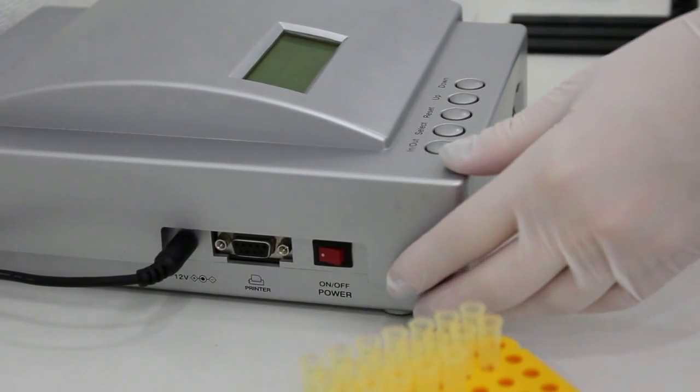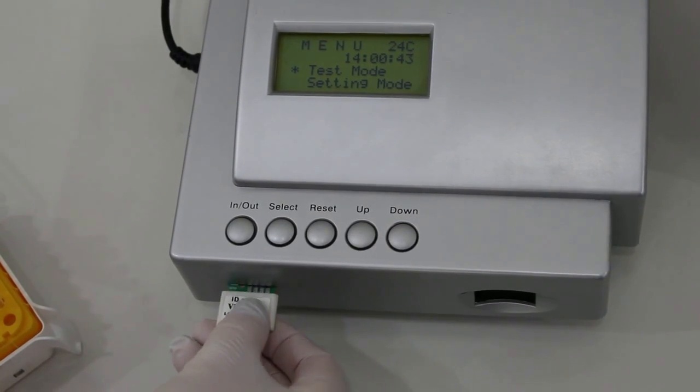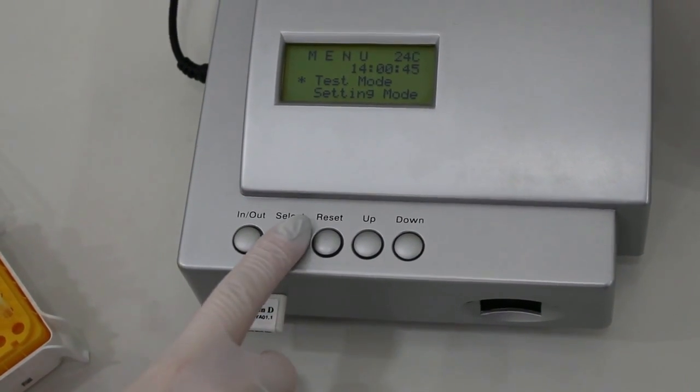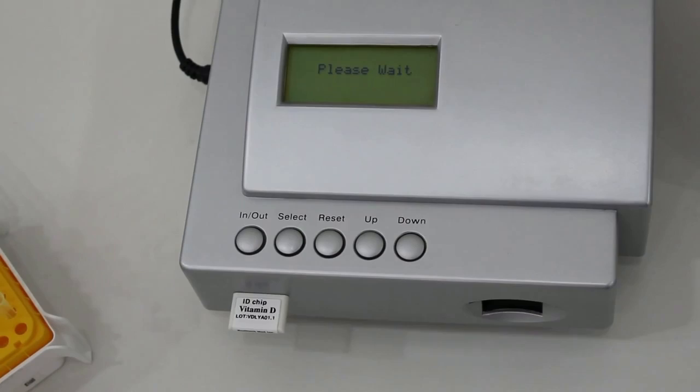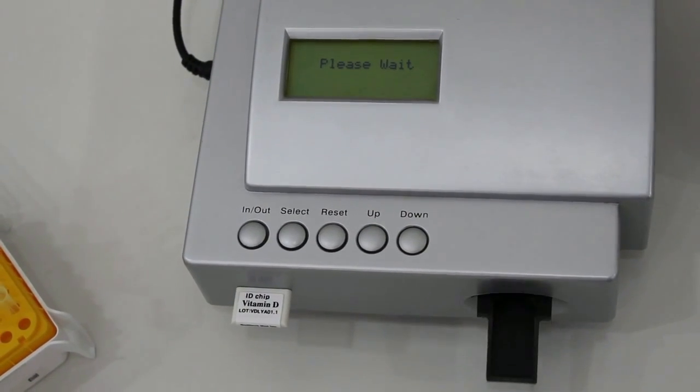Turn on the iCHROMA reader. Insert the ID chip into the ID chip port. Press the select button and the cartridge holder should slide out.